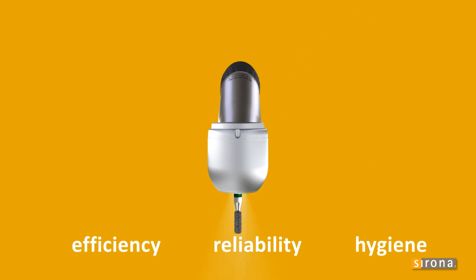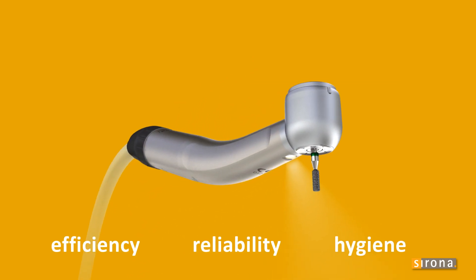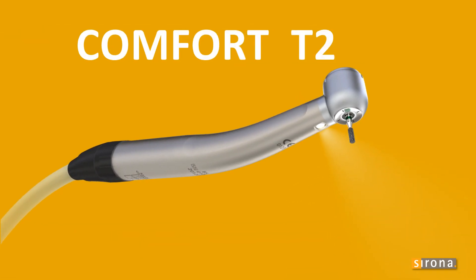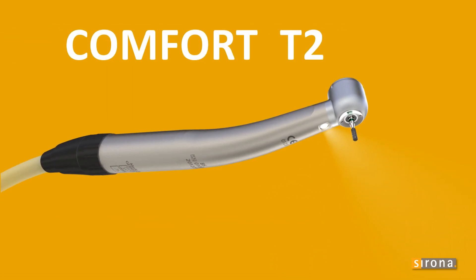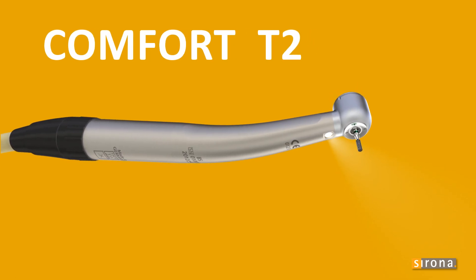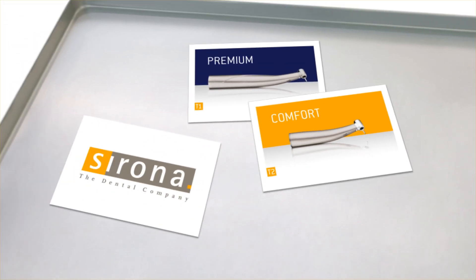With excellent hygiene, so you can completely focus on treating your patients. Two classes, one demand — we only put the best in your hands.